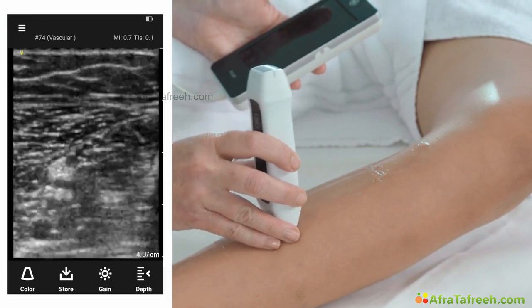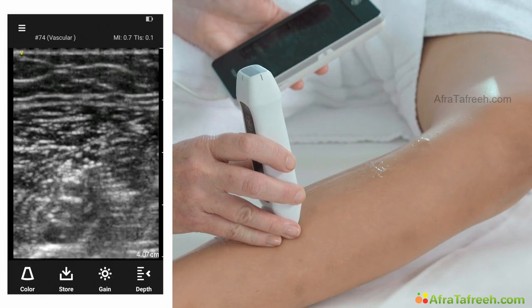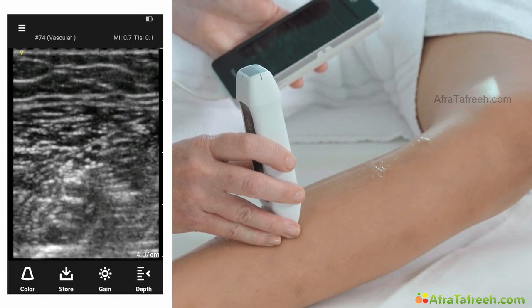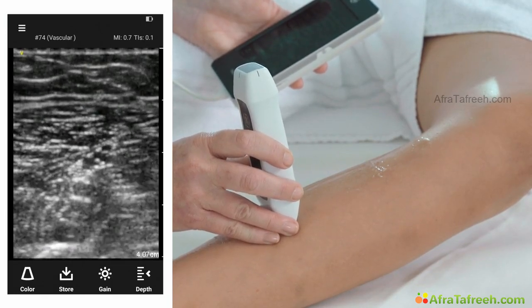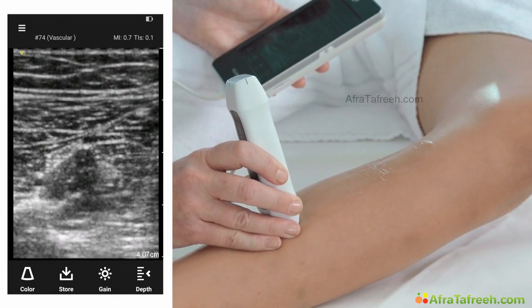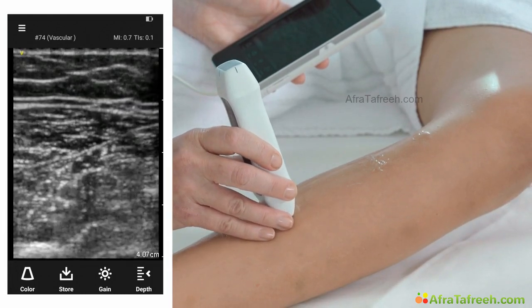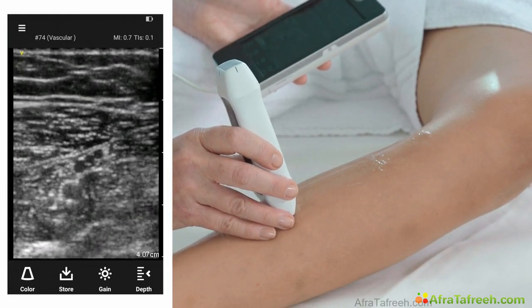Rocking the probe or tilting the probe up and down, we can see the veins stand out when we're 90 degrees to them. From here, I'm just going to do a compression to show you how they wink at us, and then the two arteries are now visible. Uncompress and you can see the veins refill.